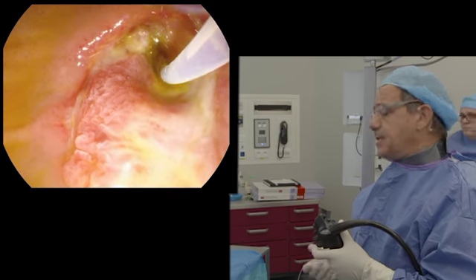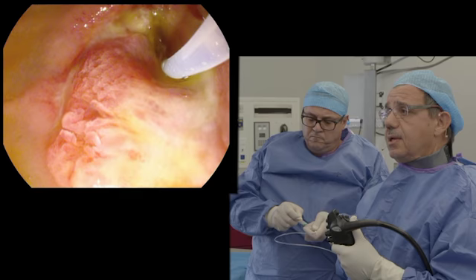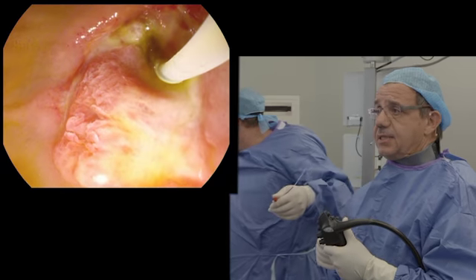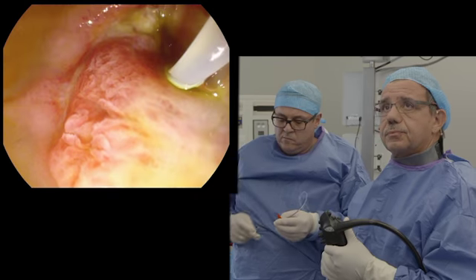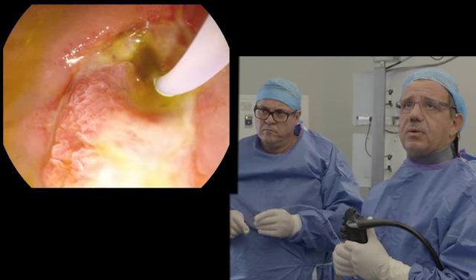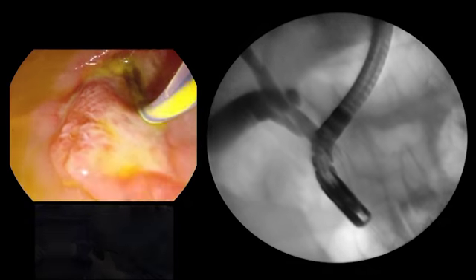Okay, now the next step is to put a wire inside and to perform a brush cytology and the biopsy to obtain the diagnosis of this stenosis. Okay, now we use a 0.035 inch hydrophilic guide wire, X-ray. Go inside. Stop. Now we do the exchange.